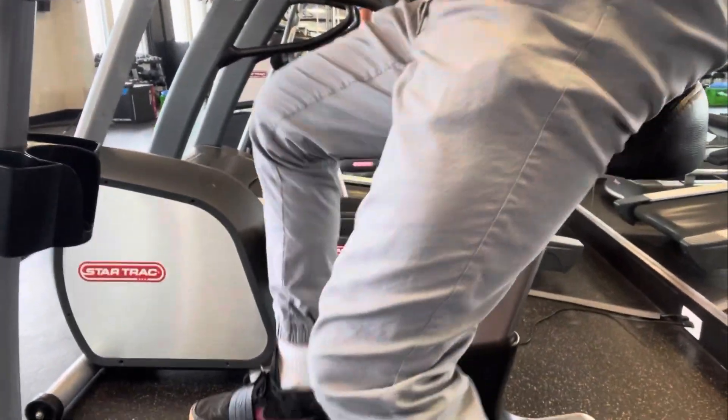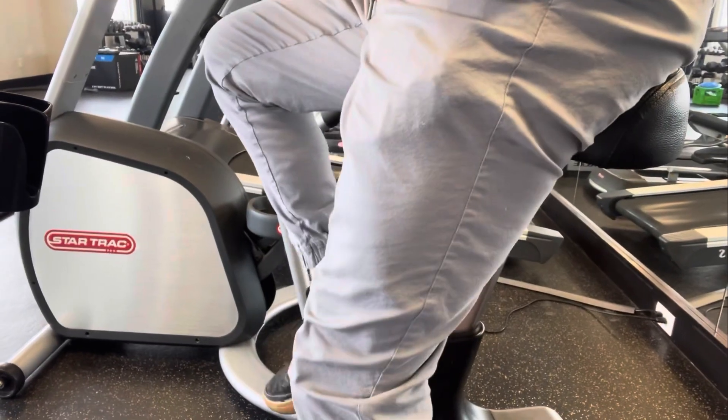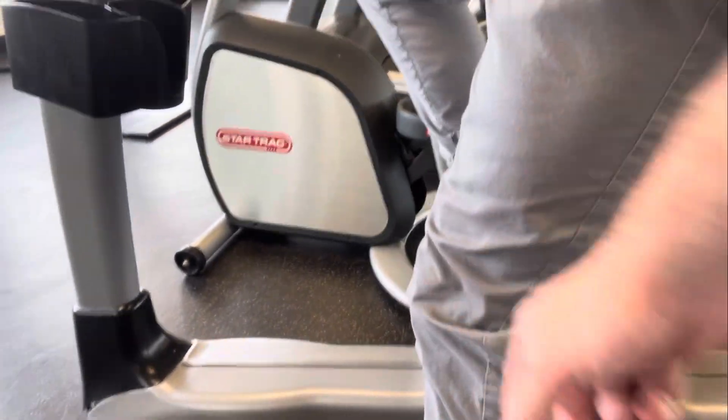VO2 max testing done on the bike — make sure the bike is set up properly. You want just a little bit of a bend in the knee for height as you go down. For Alley here, yeah, that's perfect right there — just a slight knee bend. Sometimes the client wants it a little bit higher, but make sure it's consistent.